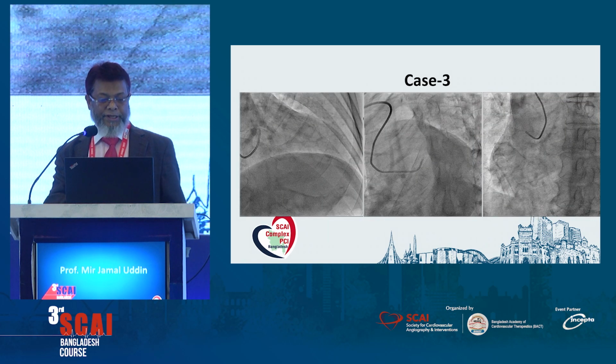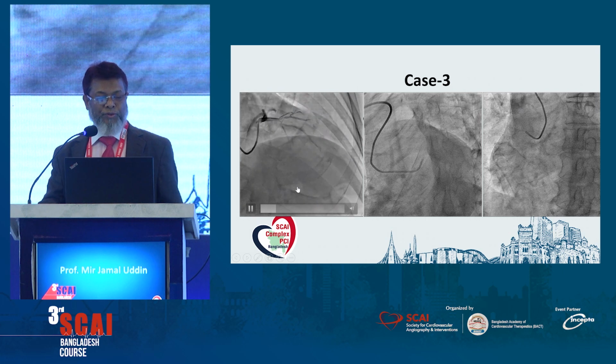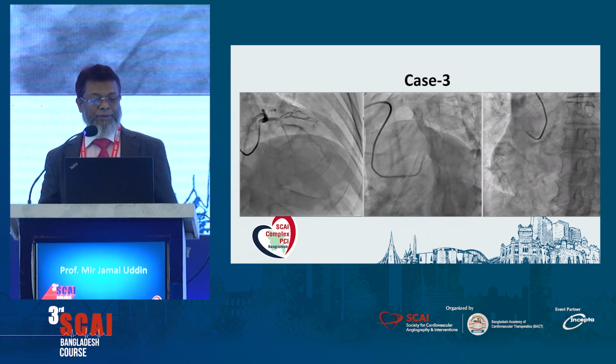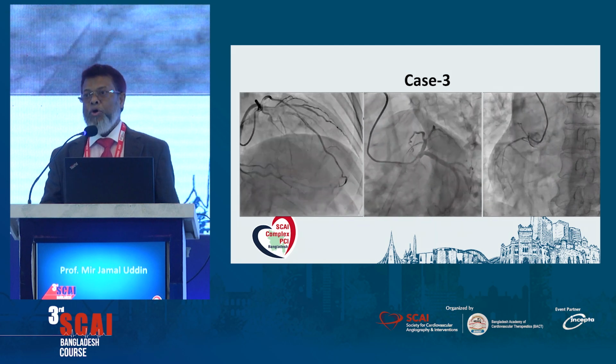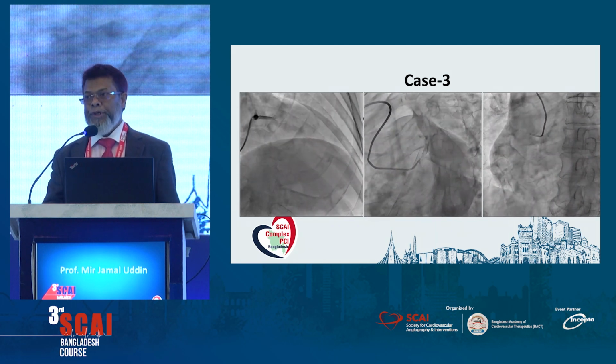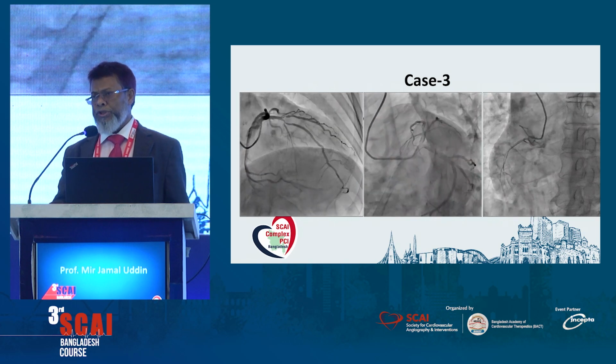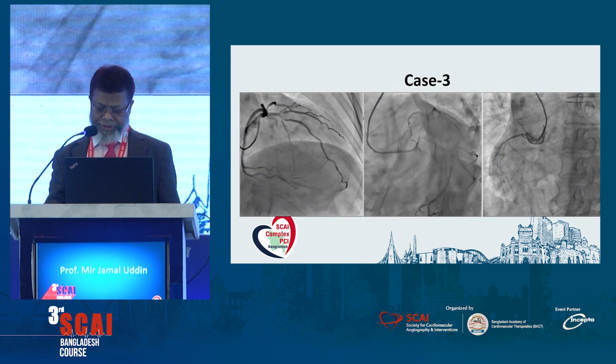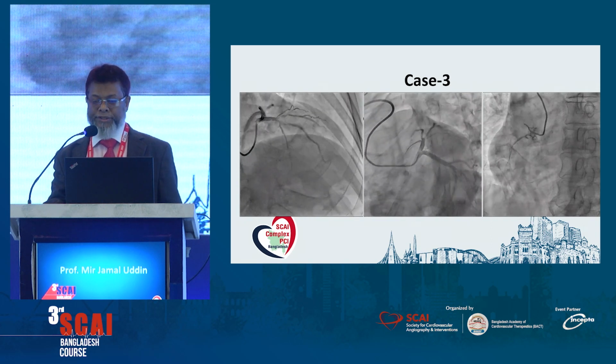And this is the final case. This is also once again LAD diagonal. The diagonal is also ostial as well as downstream. Whenever we remain within 5 millimeter from the ostium, we do not bother, we do not worry. But when there is downstream disease, then we shall have to think twice.